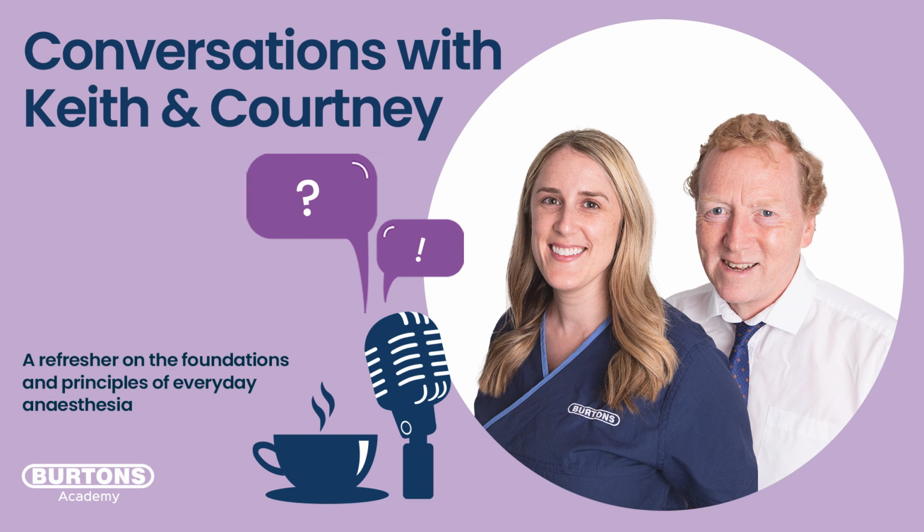We'd see the expiratory phase, it's phase 3, and then we see another phase, which would be the pause expiratory phase. So there's ways we can use something called color-coded capnography, which I think we should have another podcast to talk about, that shows us how we can actually differentiate those.